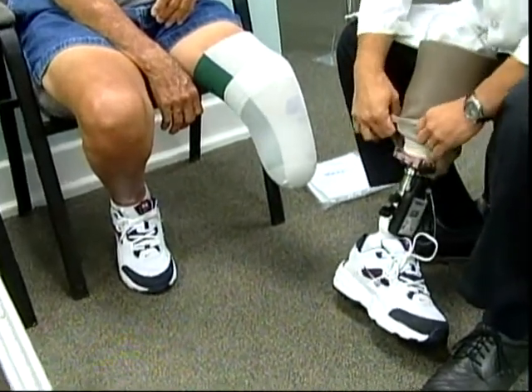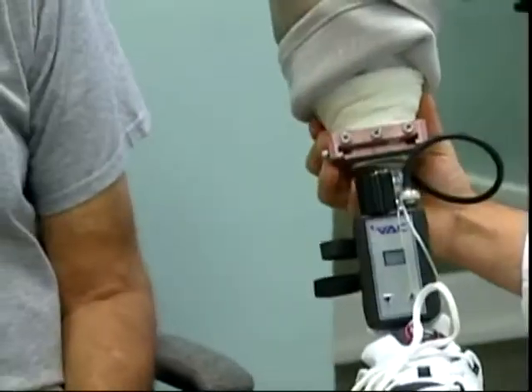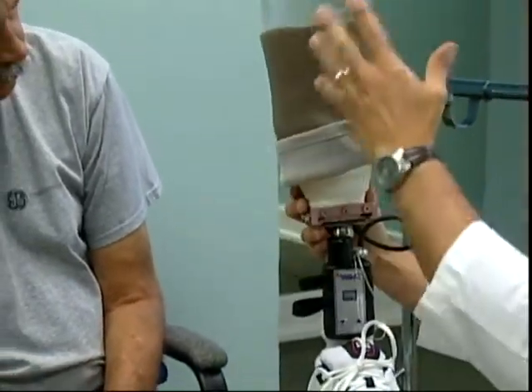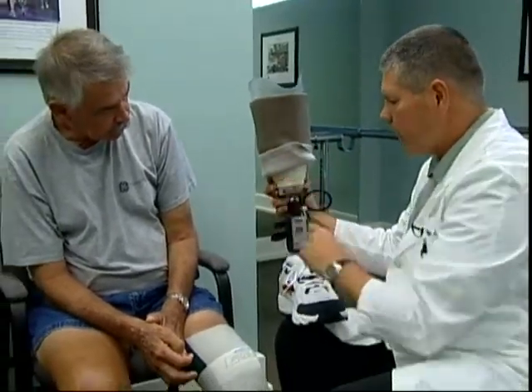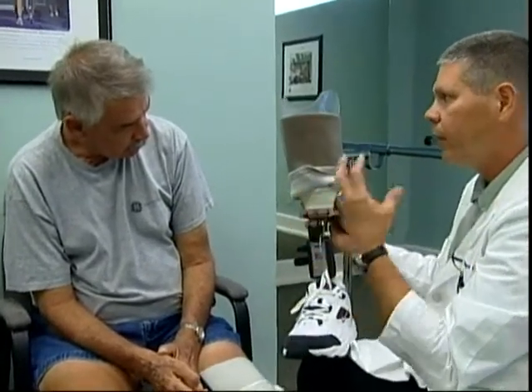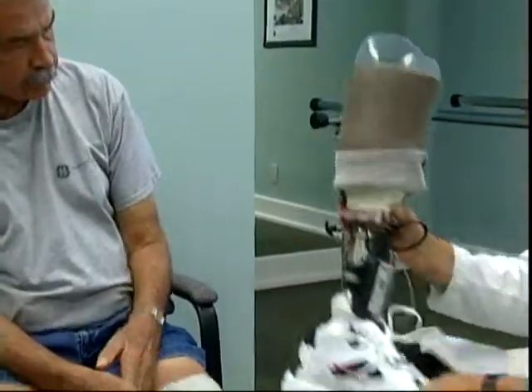Okay. And the way this works is there's an electronic pump that's attached down here at the bottom. And we're going to put him into the prosthesis, roll this sealing sleeve up onto the upper thigh. What that does is creates an airtight seal on the upper thigh. We have an airtight seal inside the socket, and then Tony, you're going to flip this little button right here. You're going to hear a little whoop as the air evacuates out of the system, and the system's good to go. So let's see it in action. See what happens.